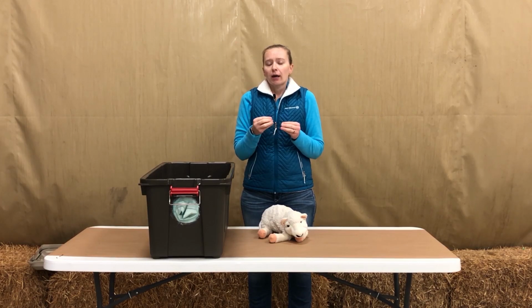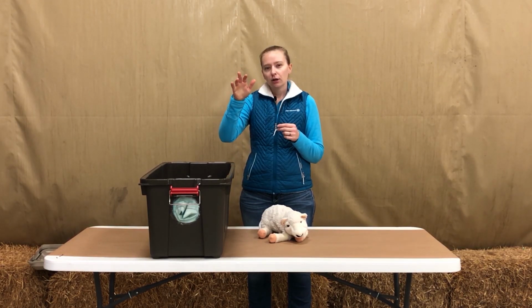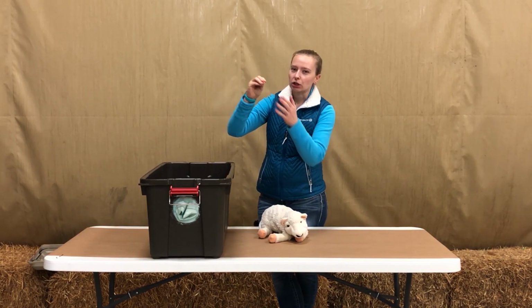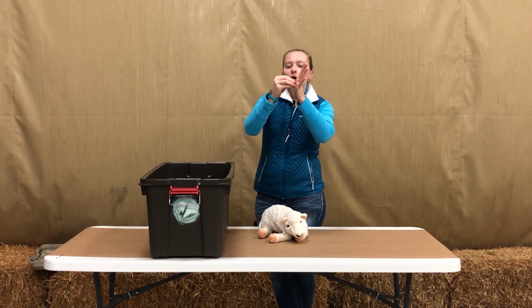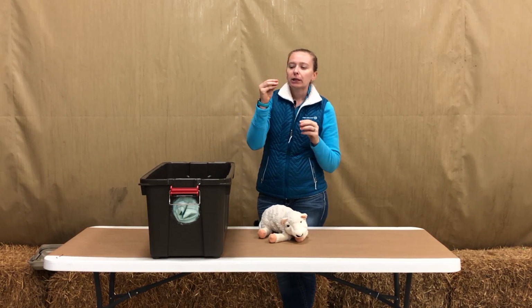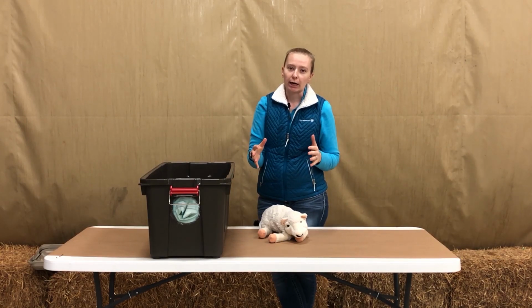To describe how ring womb feels, you would try to sleeve her or try to reach the animal. You would actually feel a blockage. It would almost be like you could not pass through. It'd be very tight. And you might be able to get 1 or 2 fingers in, but maybe not all the way through. Definitely an animal not coming out.